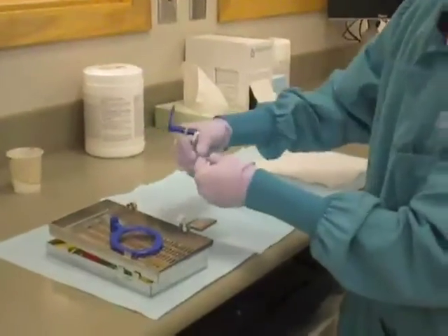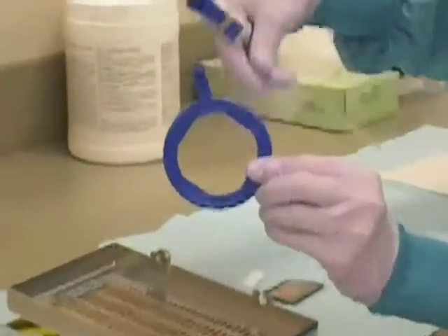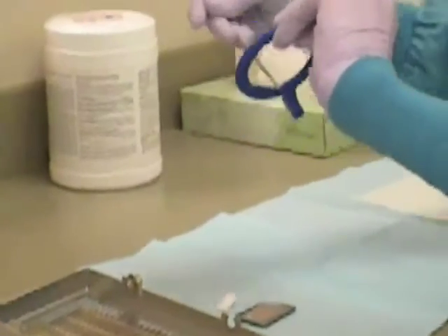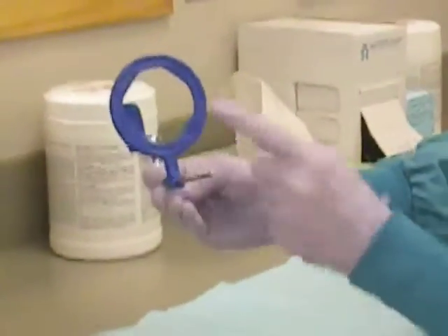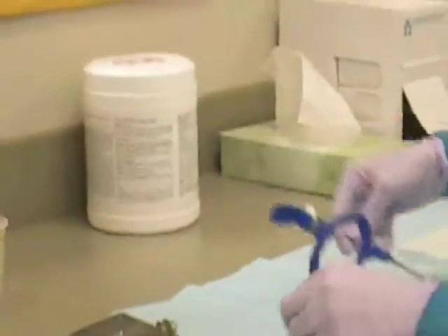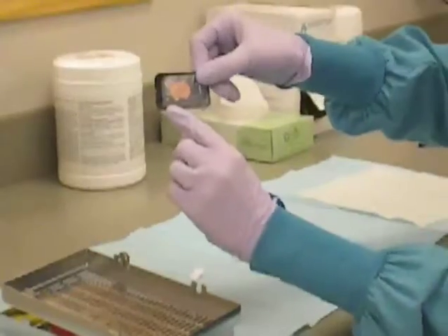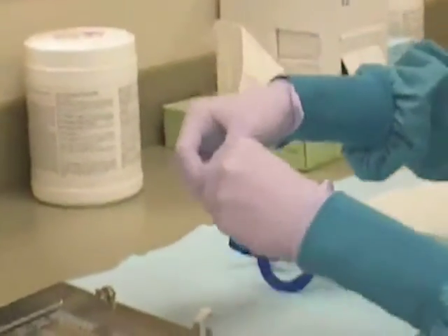Thread the ring that is not offset onto the rod so the PID indentations face the operator. Take a size 1 phosphor plate and apply the sticker to the side of it with an A to help aid with fitting the plate into the bite block.